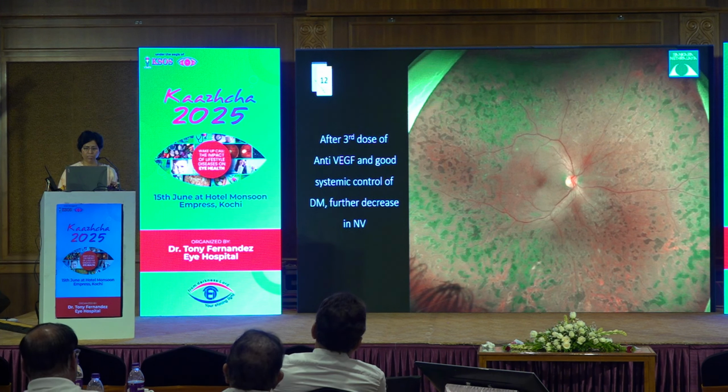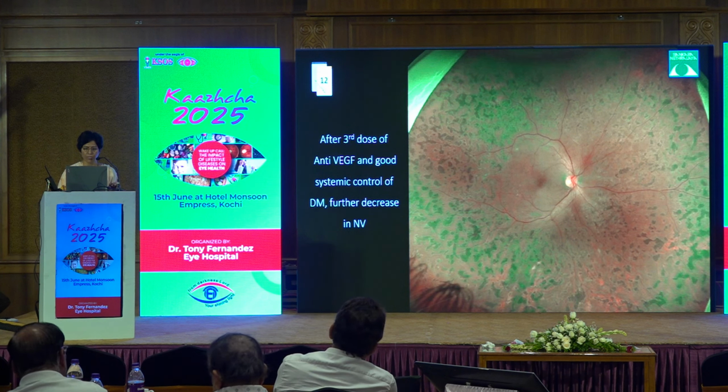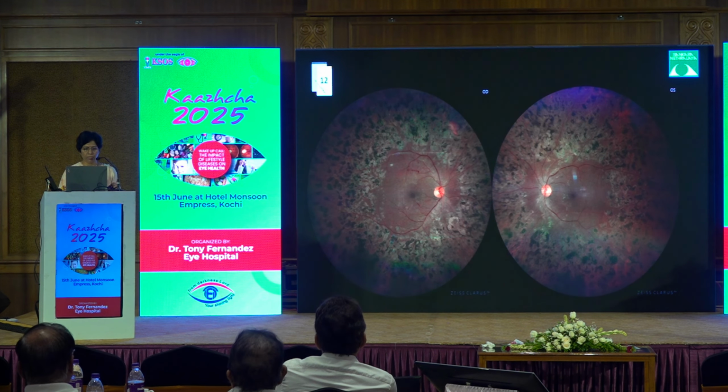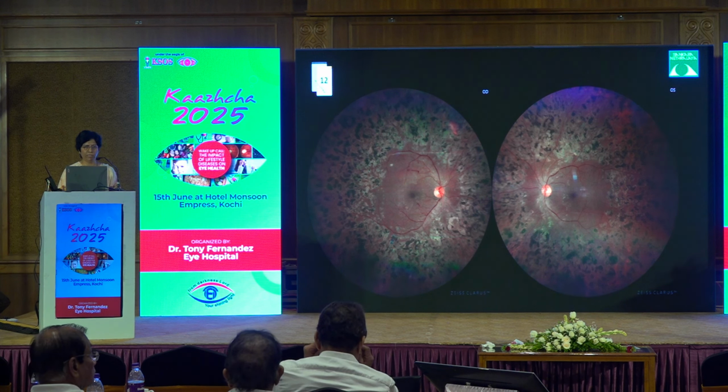You can see the retina is absolutely well lasered. There is no space for further laser or cryo, etc. So that's why I gave this anti-VEGF to this patient. And this is the latest photo from the last month. You can see again there are some new vessels here. So anti-VEGF is not the full and final treatment.